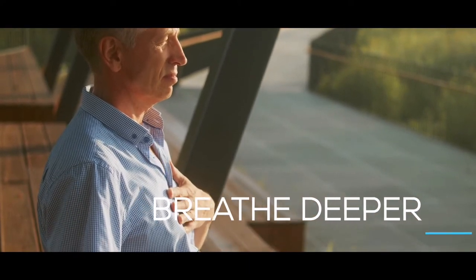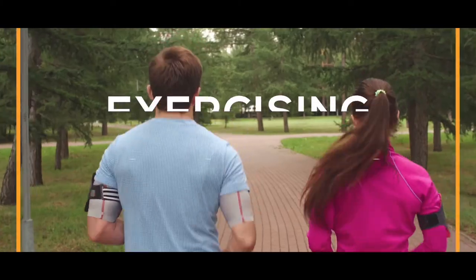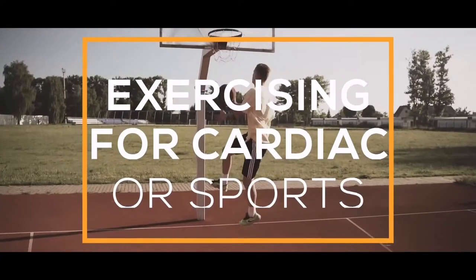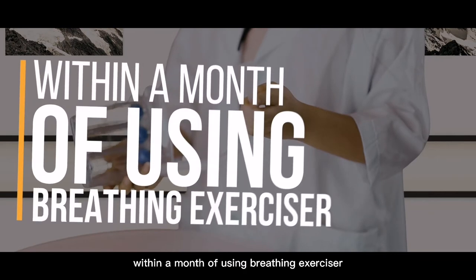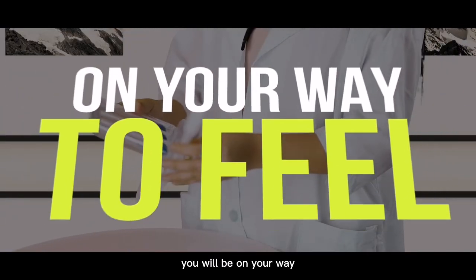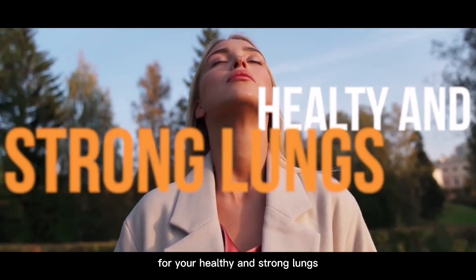You will breathe deeper and more effortlessly than ever before, whether you're exercising for cardiovascular fitness, sports, or nothing at all. Within a month of using the Breathing Exerciser, you will be on your way to feeling the wonderful effects of healthy and strong lungs.